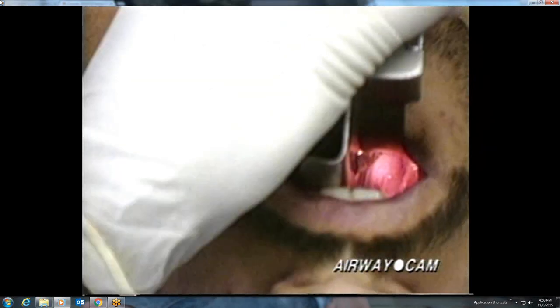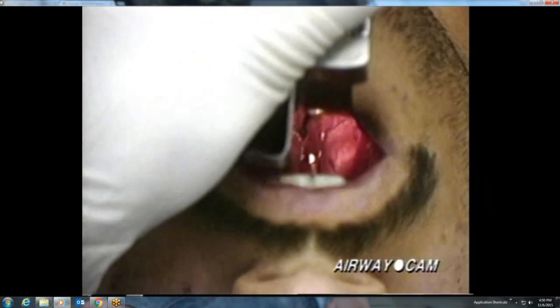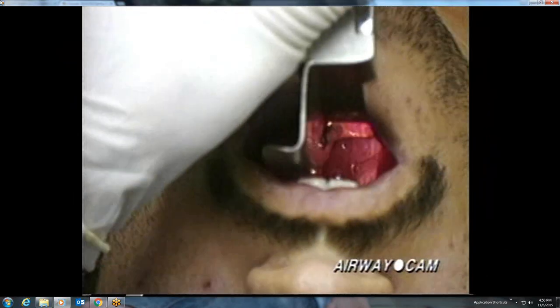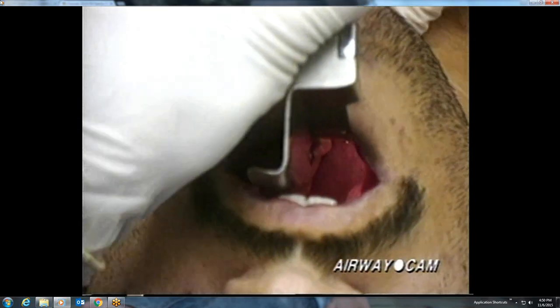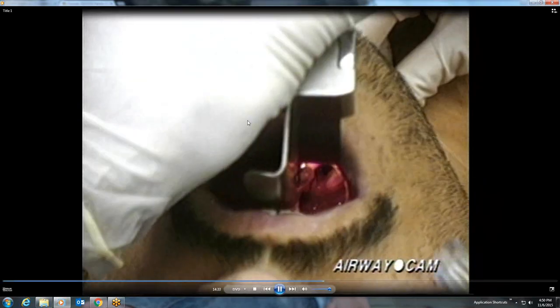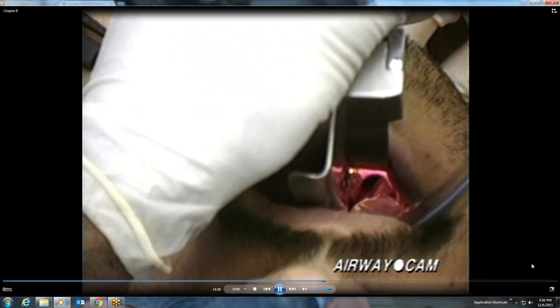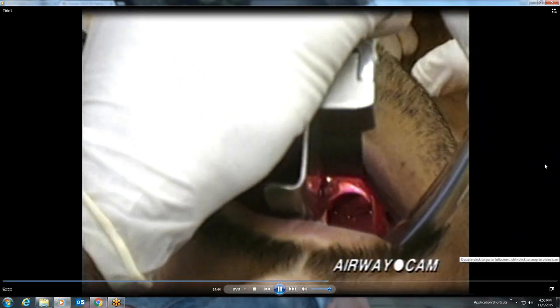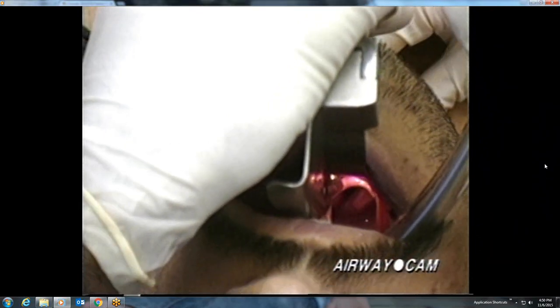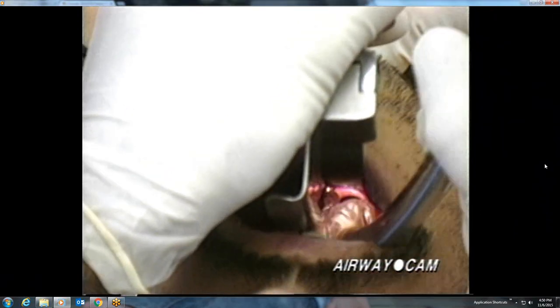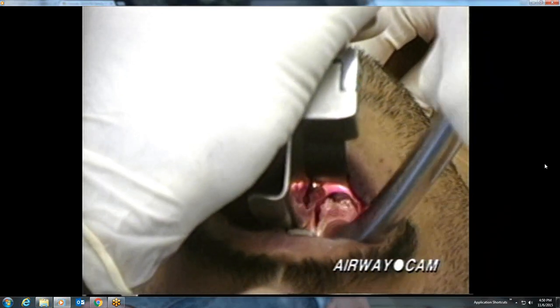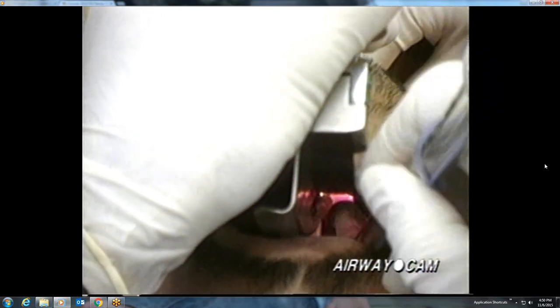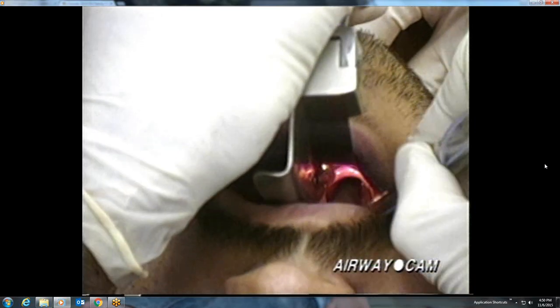The next case involves a Macintosh No. 3 blade. Following a push-off technique for opening the mouth, the blade is advanced further along the posterior pharynx. The epiglottis and posterior cartilages come into view surrounding the dark glottic opening. An assistant provides laryngeal manipulation. Exposure of the glottis alone does not ensure proper tube placement — careful attention as the tip of the tube is inserted without taking your eye off the target is critical for preventing esophageal placement.